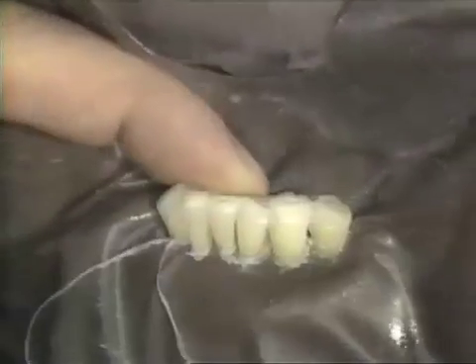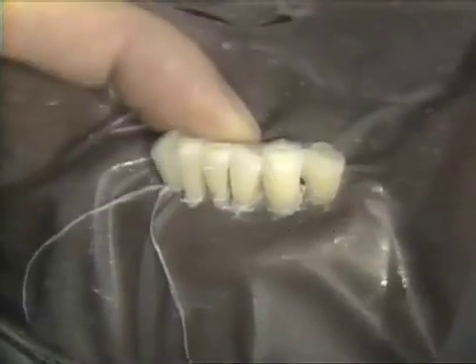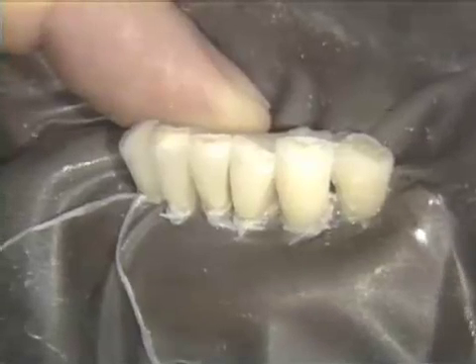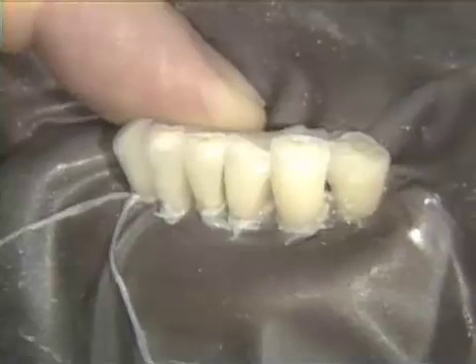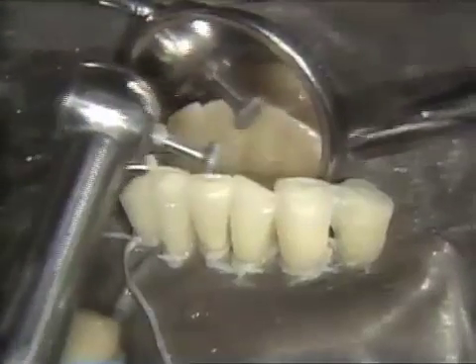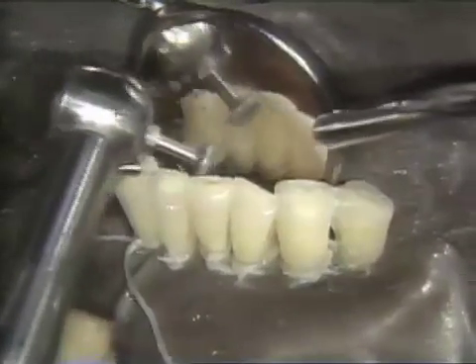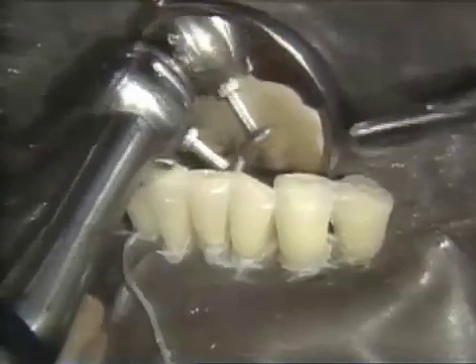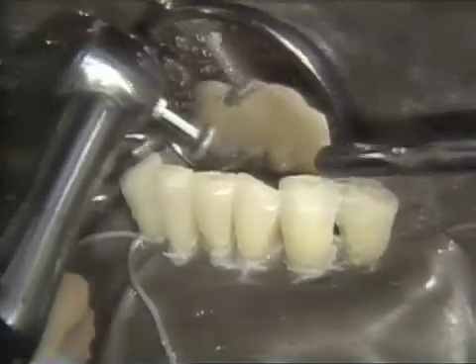The light-cured matrix is tried in on the linguals of teeth number 23, 24, and 25. The composite on the linguals of these teeth will be placed and cured in one layer. The cervical clamp has been removed to make sure the matrix seats fully and adapts well to the tooth surfaces. The enamel surface is roughened slightly with a diamond for better adhesion. No glass ionomer is placed since the restoration does not involve dentin.